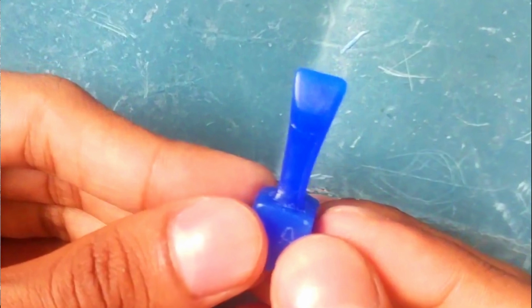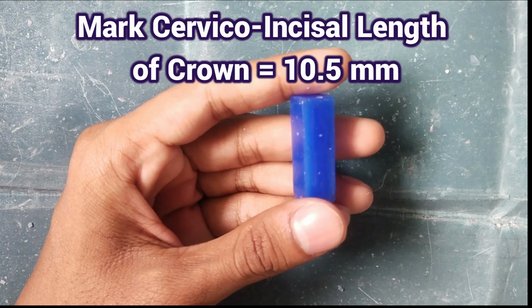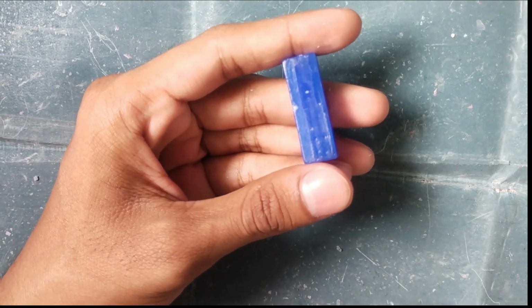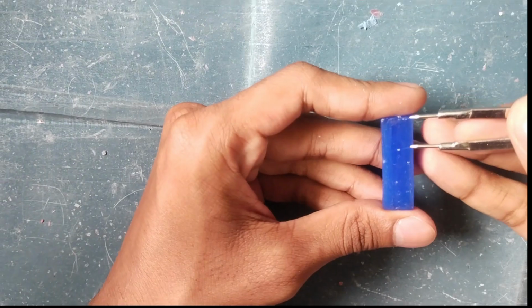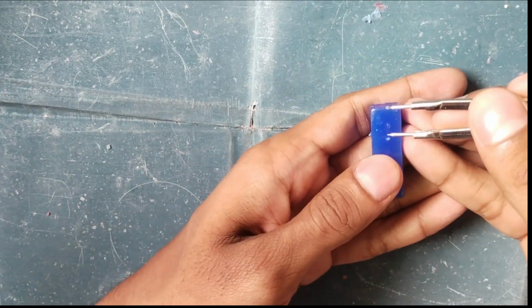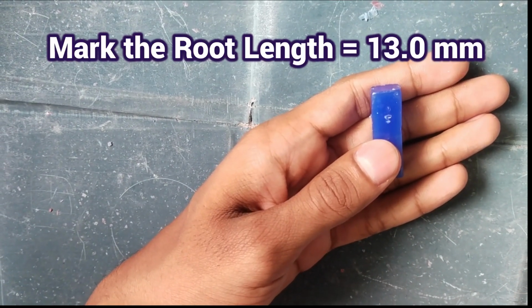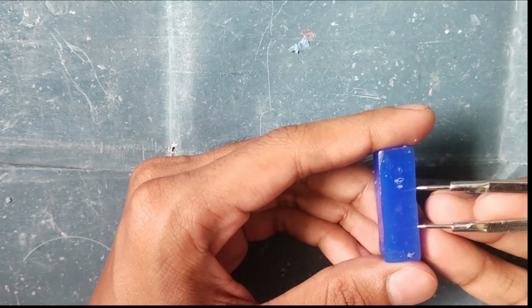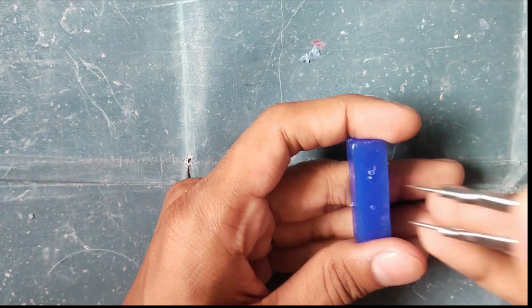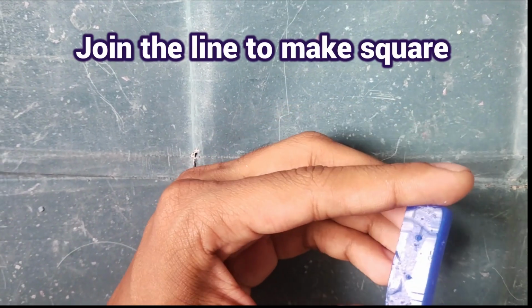We are going to carve permanent maxillary central incisor. First of all, we have to mark cervico-incisor length, which is 10.5 mm to all the sides of the block. Now mark the root length, which is 13 mm. Now join all the points.